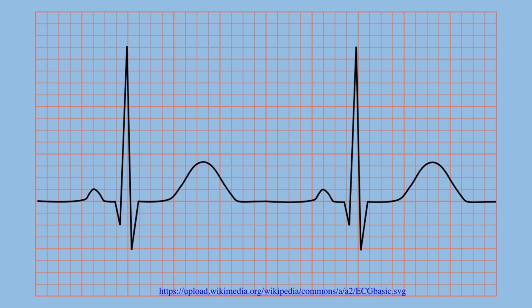First of all, this is a normal strip showing the P wave, the QRS complex, the normal ST segment coming exactly on the isoelectric line, and then the T wave, and then the next complex. Whenever you are looking for any arrhythmias you have to check the P wave's presence. If the P wave is preceding the QRS complex and all the QRS complexes are succeeding the P waves, then you are dealing with sinus rhythm — this is very important to note.